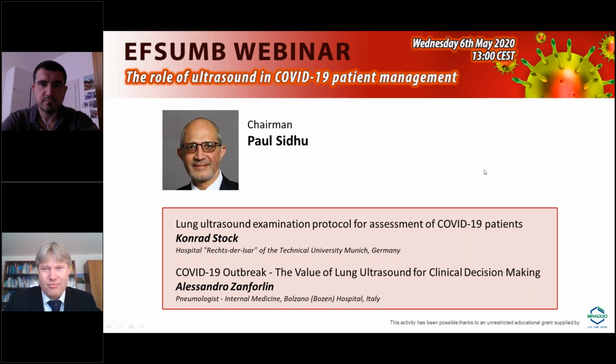Okay, I'm going to wrap it up with one final question here, and it's for either of you. COVID-19 causes microvascular thrombosis. Can the ultrasound detect poorly aerated surfaces of the lung? Alessandro. Can you repeat the question, please? Microvascular thrombosis, can ultrasound detect poorly aerated surface of the lungs? I think I can answer this, and I think you probably can, yes, very small areas. We have seen it on our imaging on the ITU, very 3 to 5 millimeter areas of low reflectivity. And this may be microvascular thrombosis, who knows, until we have the pathology.